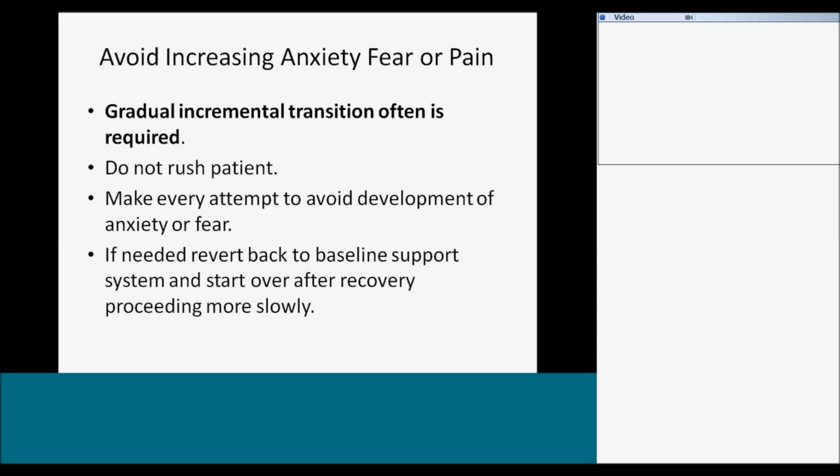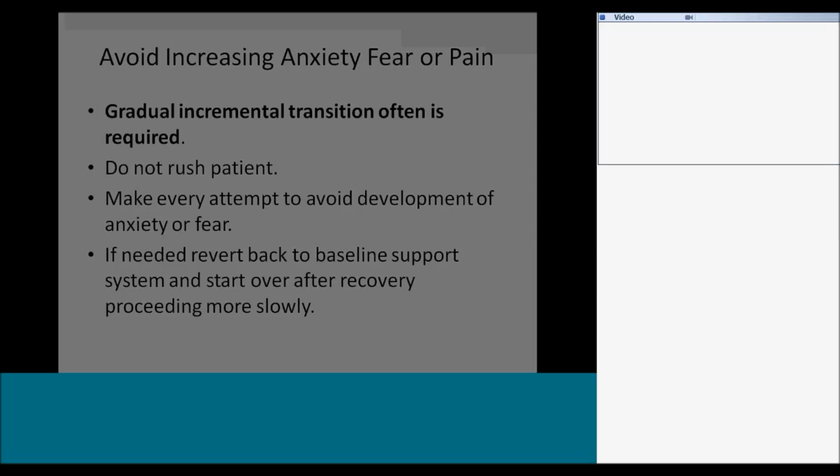Now, I talk about this. Those are rare cases. It's not a normal thing, but it's something just to be aware of. So if needed, revert back to baseline support, put them back on their other means of support, allow them to recover, and then proceed again more slowly the next time if needed.